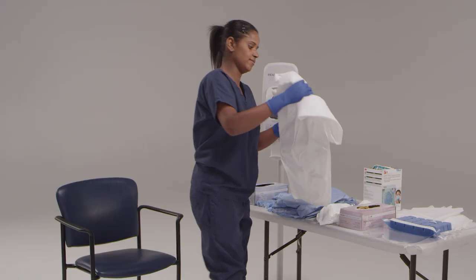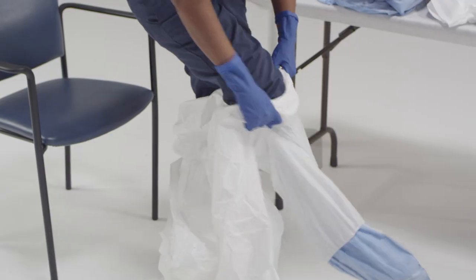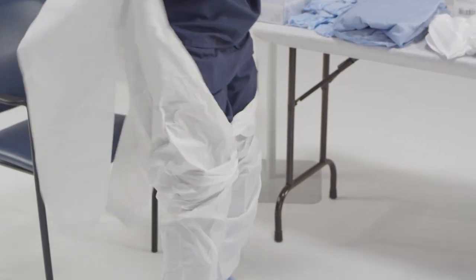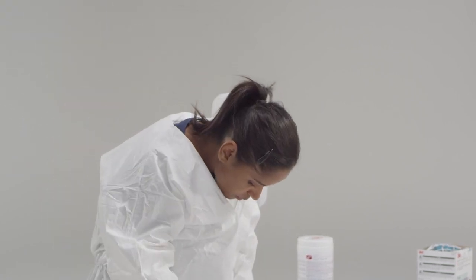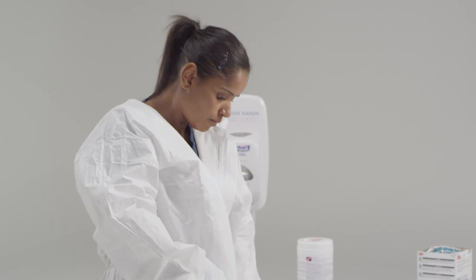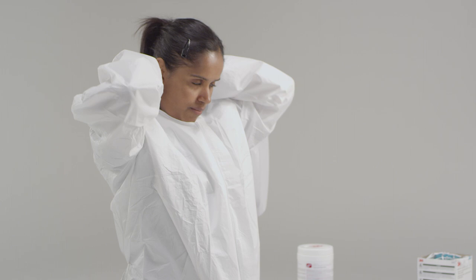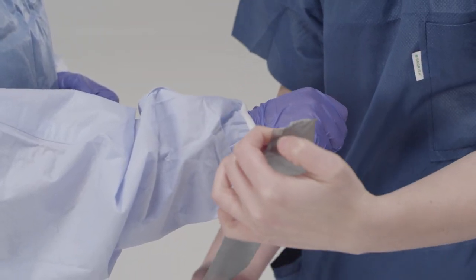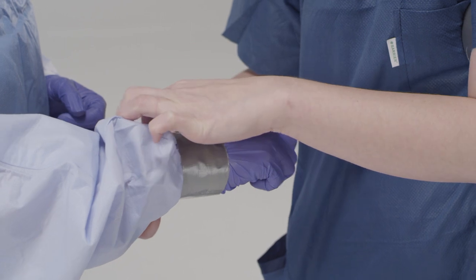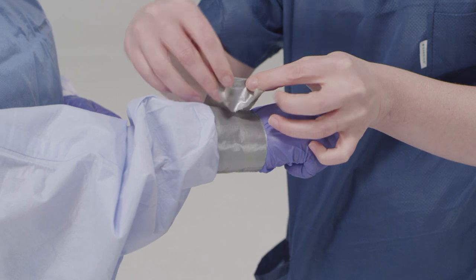Now put on the coverall. If available, coveralls with thumb hooks help secure the cuffs over the inner glove to help ensure there is not a gap between the glove and the cuff of the coverall. Pull up the zipper completely. Ensure the coverall is large enough to allow unrestricted freedom of movement. Ensure cuffs of inner gloves are tucked under the sleeve of the coverall. If a coverall with thumb hooks is not used, facilities may consider taping the sleeve of the coverall over the inner glove to prevent potential skin exposure from separation between the sleeve and inner glove during activity.